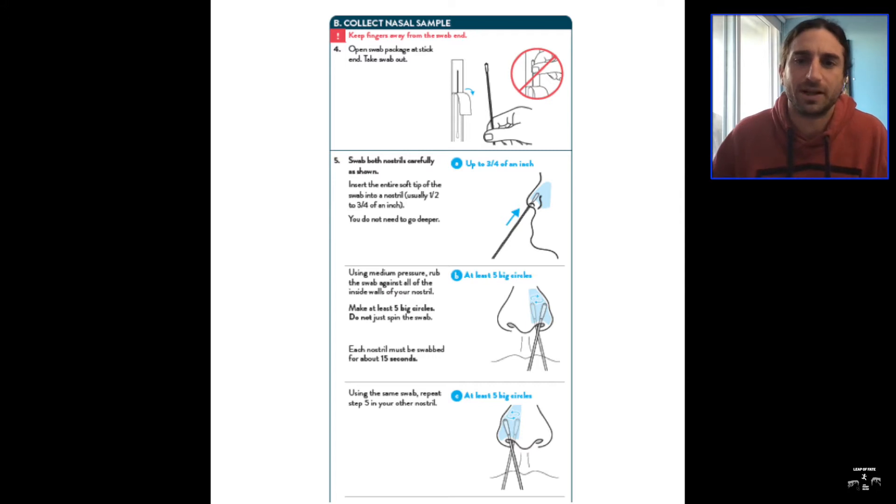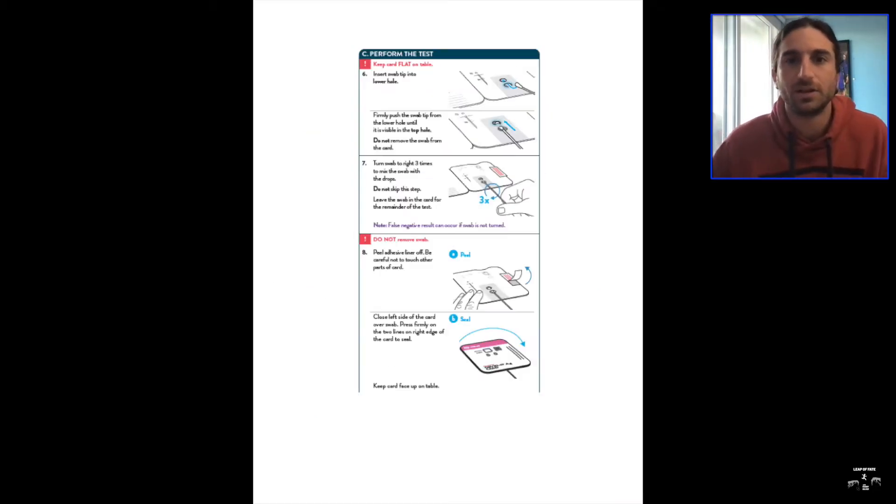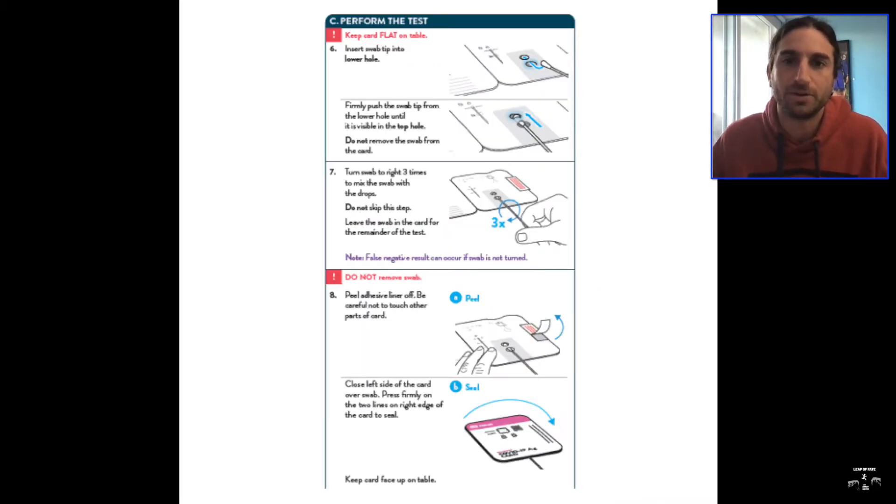Make sure you turn the swab multiple times, as shown in the pictures. It may be a bit uncomfortable — you may sneeze, you may cough, you may get a little runny eye, but it is what it is. Make sure you do both nostrils, and then you put it inside the packet so it will start reading the test and give results based off of what you did.